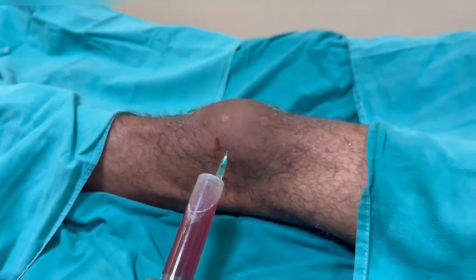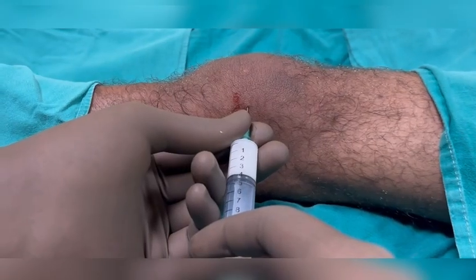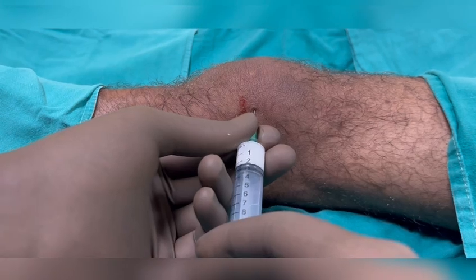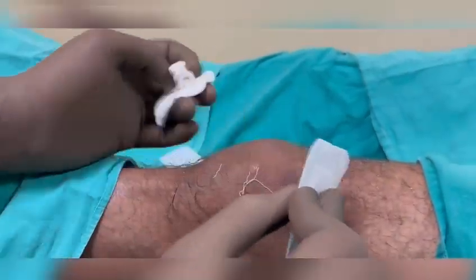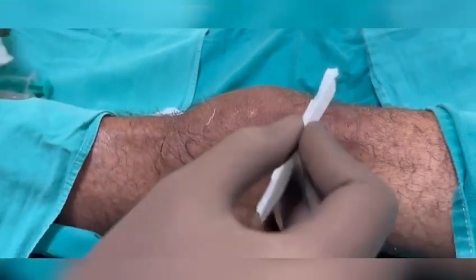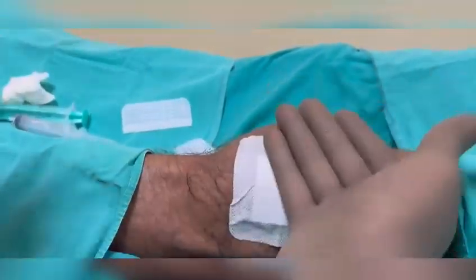Once you are done, I give 80mg of Depo-Medrol along with 2ml of 1% xylocaine, then we apply a G-dressing and put on a compression dressing for around 72 hours. This is how you aspirate an inflamed prepatellar bursitis and give a steroid injection.